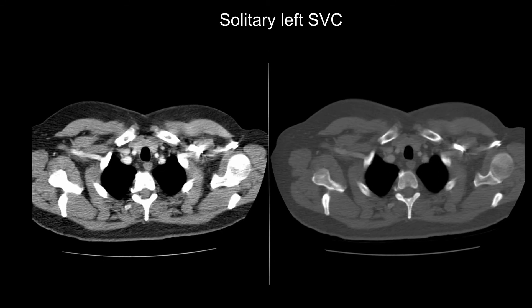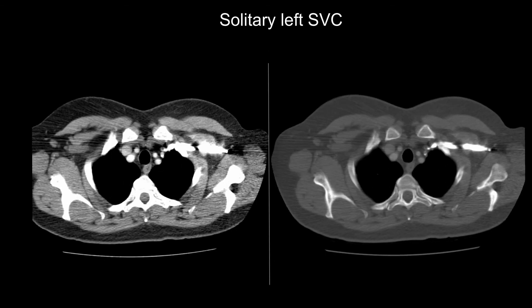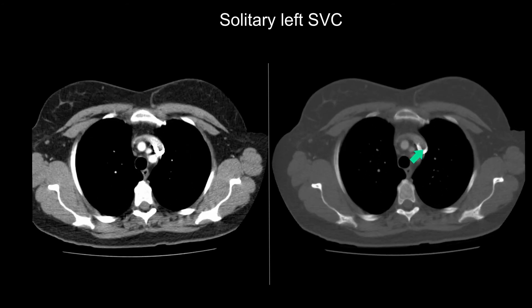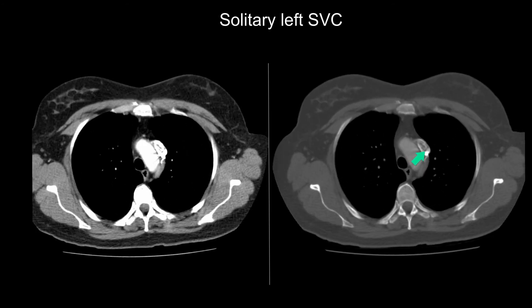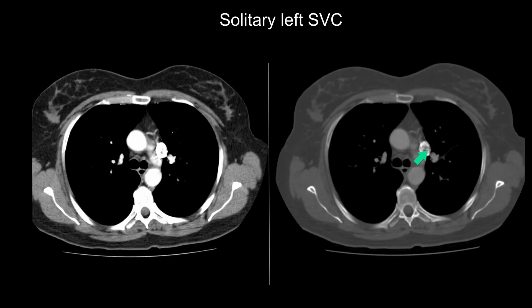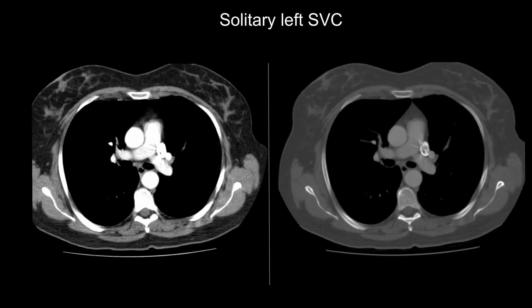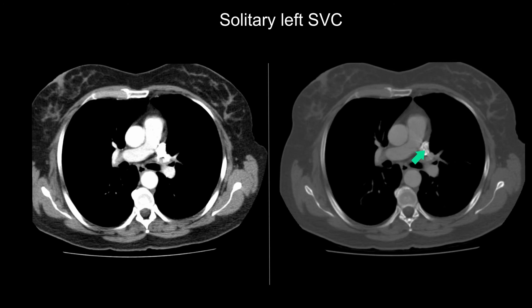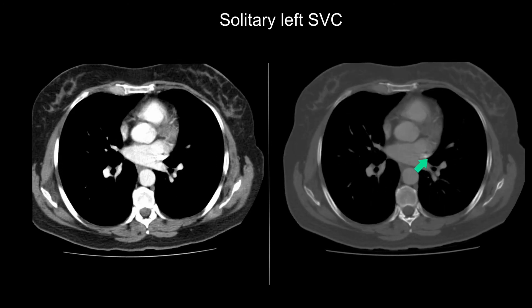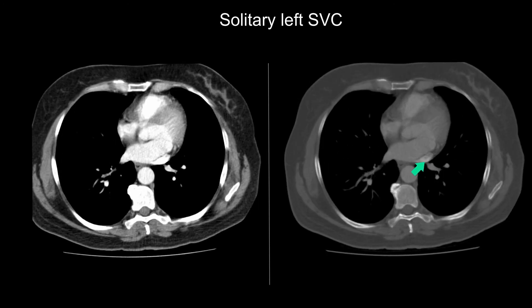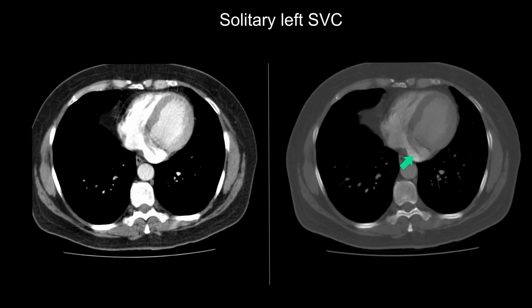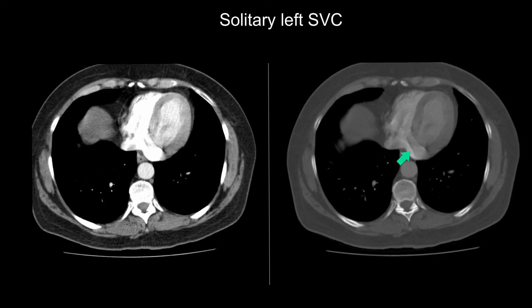Here is a patient with a solitary left SVC. It receives blood from the left brachiocephalic vein. Note that there is no right-sided SVC. As a consequence this solitary left SVC is larger than it would have been had a double SVC been present. Here is the coronary sinus.